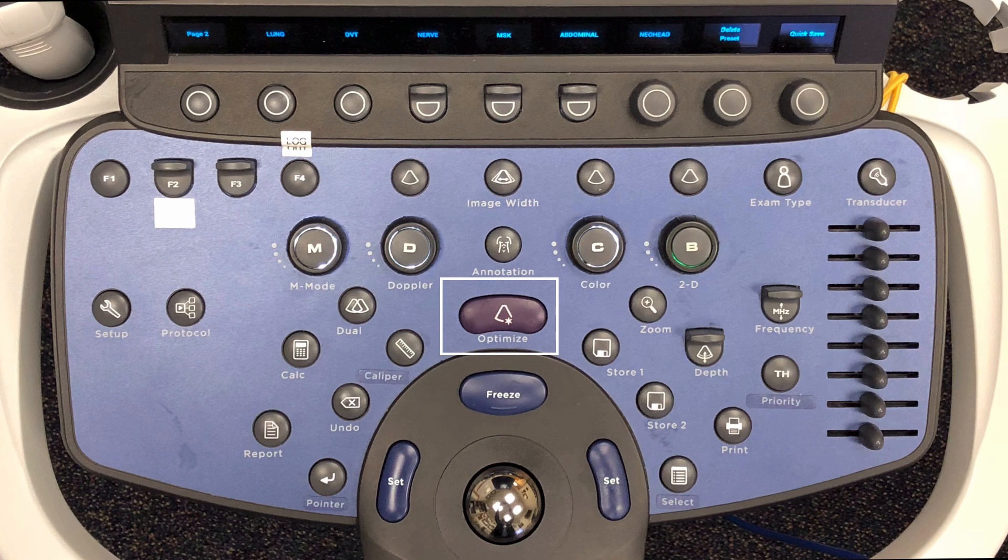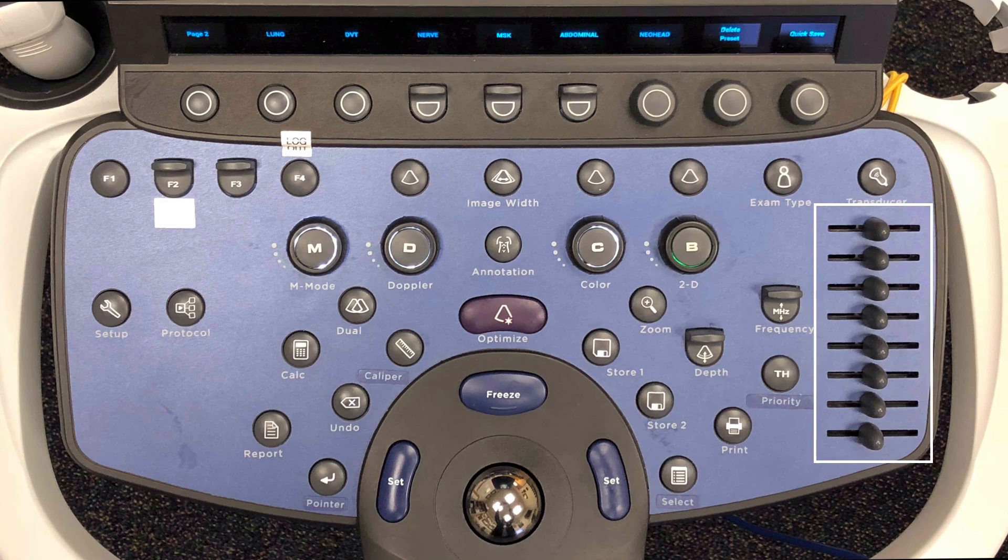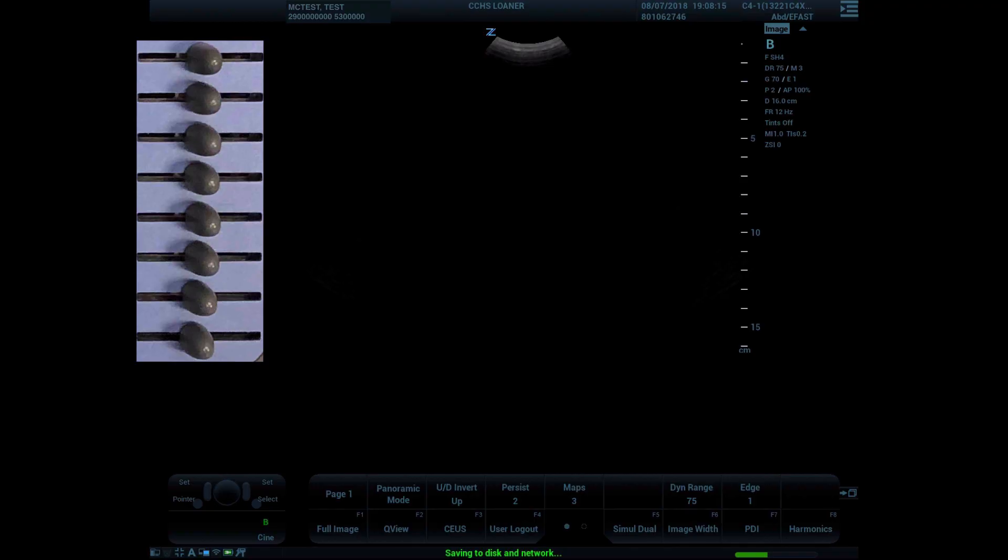Let's review adjusting gain on the system. The first thing you should do when obtaining an imaging window is to press the optimize button — this uses a computer algorithm to adjust gain based on the image acquired. To then adjust overall gain, turn the dial around the B button to increase or decrease the overall gain of the image. You can then fine-tune gain with the time gain compensation sliders. Each slider on the TGC corresponds to a depth on the image: the higher sliders are in the near field, the lower ones in the far field.